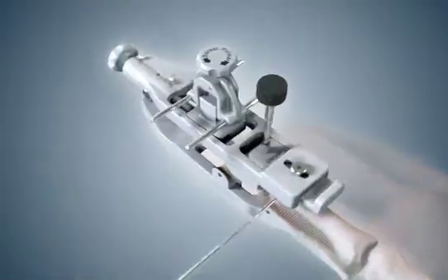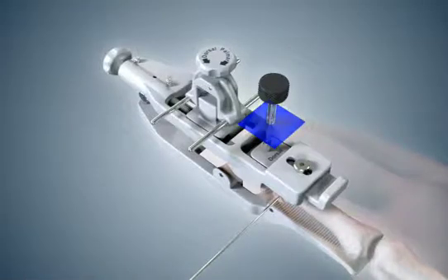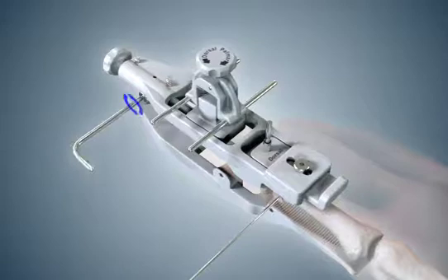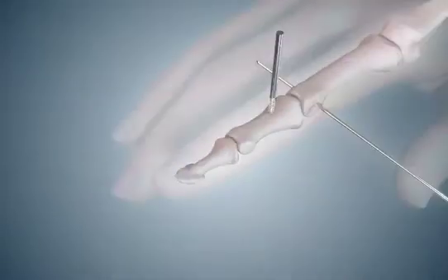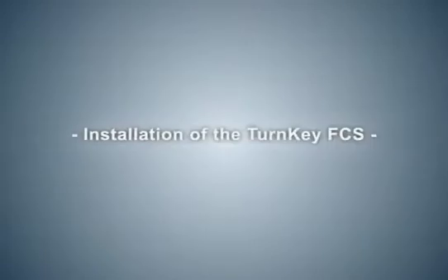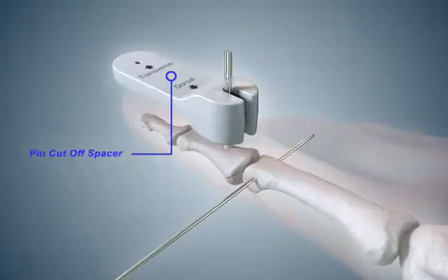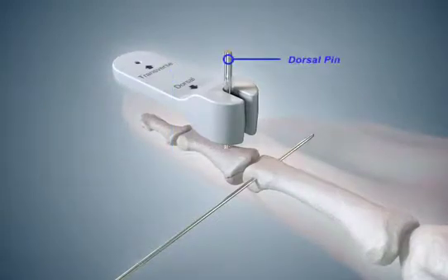Remove the transverse pin guide. Cut the dorsal pin just below its shoulder to allow for pin placement guide removal. Loosen the distal lock screw and remove the pin placement guide from the finger. Select the pin cutoff spacer. Place the thick end of the spacer over the dorsal pin and against the skin of the patient's finger. Cut off the dorsal pin flush with the spacer.